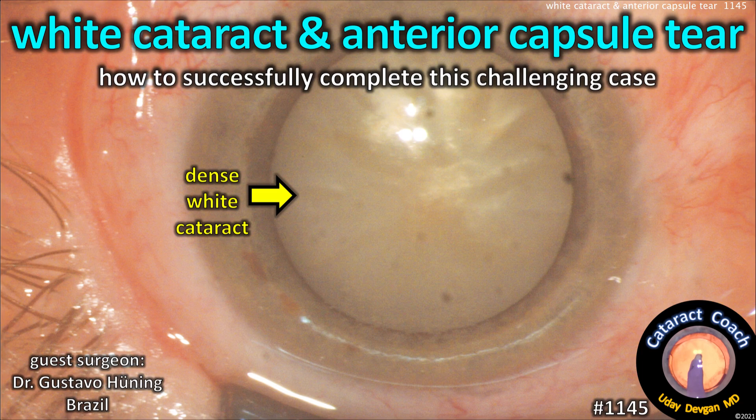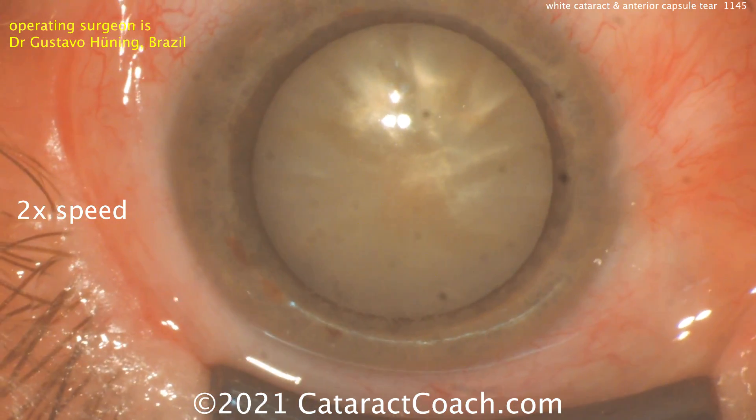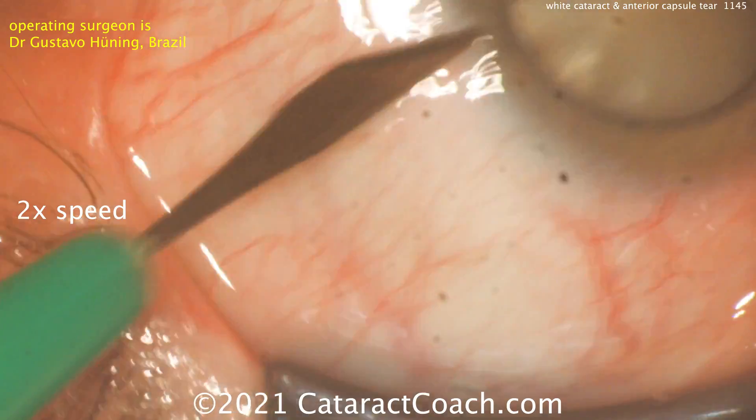CataractCoach.com presents a white cataract and anterior capsule tear case — how to successfully complete this challenging surgery. Our guest surgery is performed by Dr. Gustavo Heuning from Brazil.